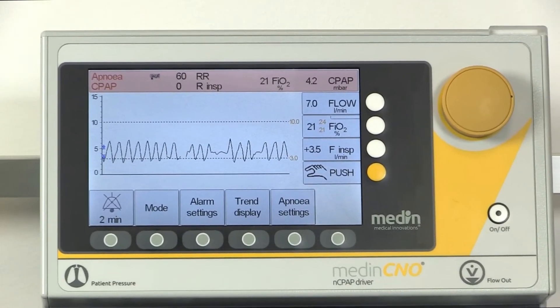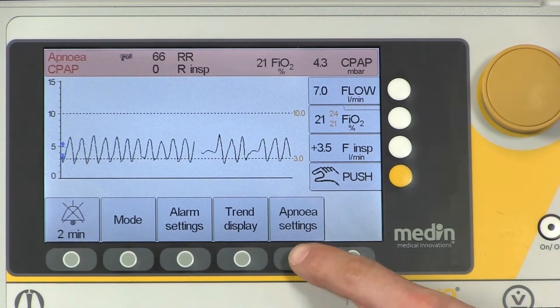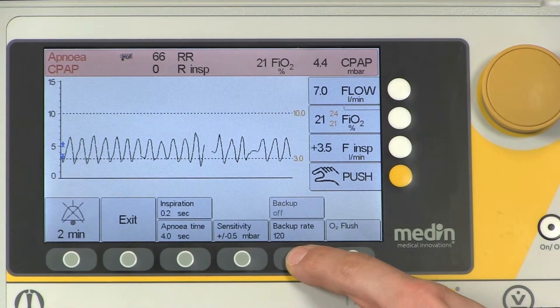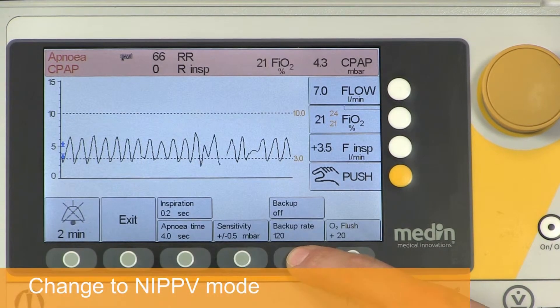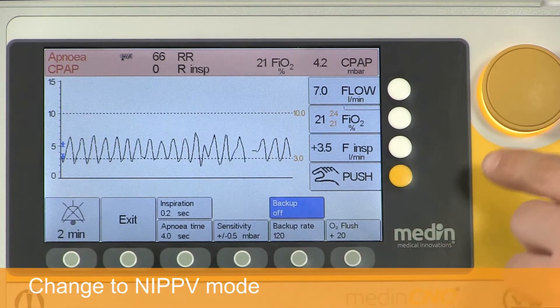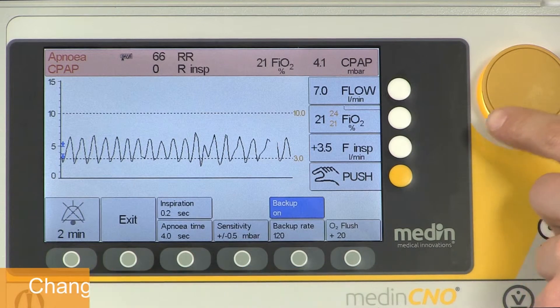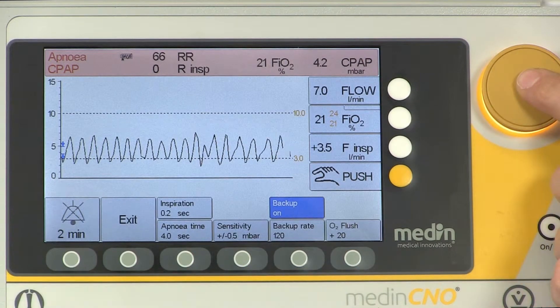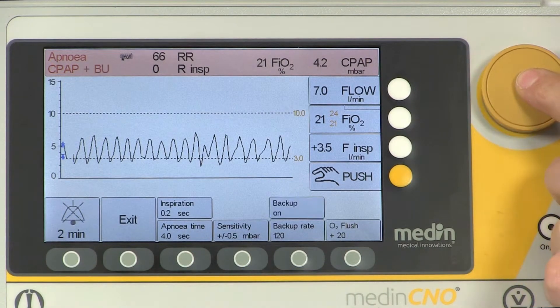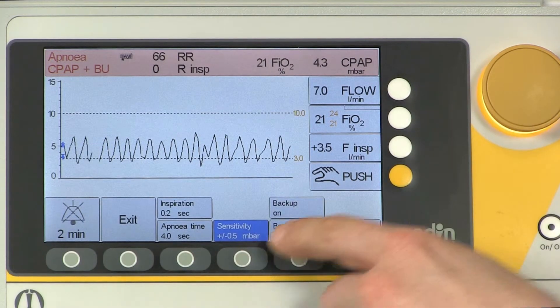To access the NIPPV mode, you first activate the Apnea CPAP mode. You then turn on the backup function and turn off the trigger sensitivity.